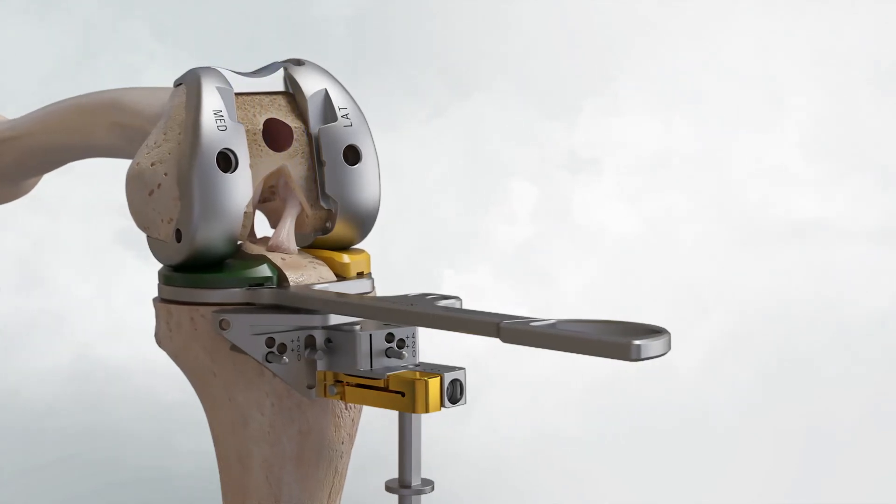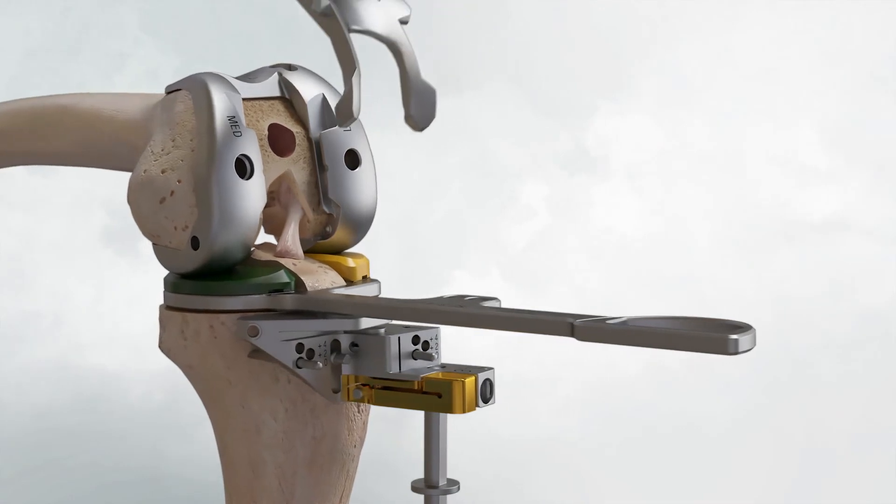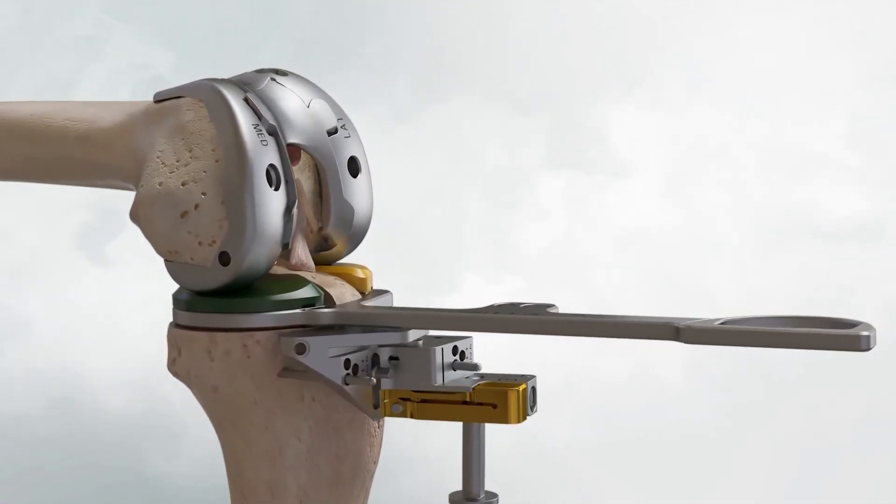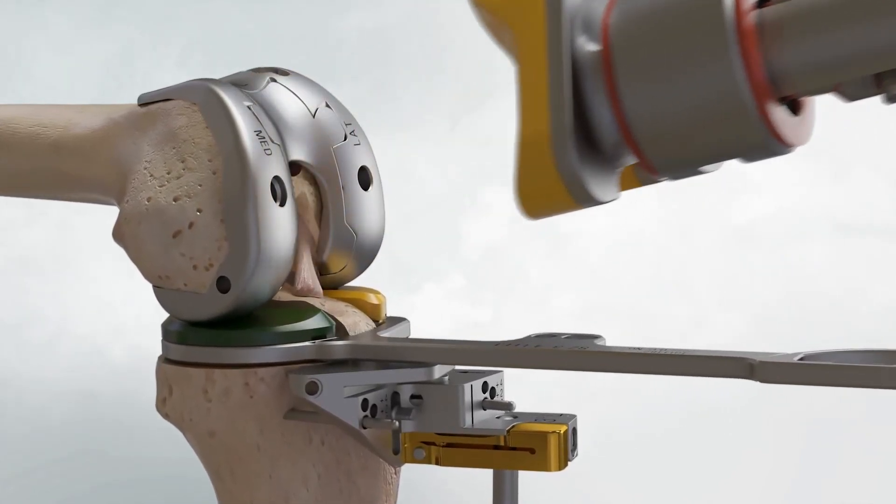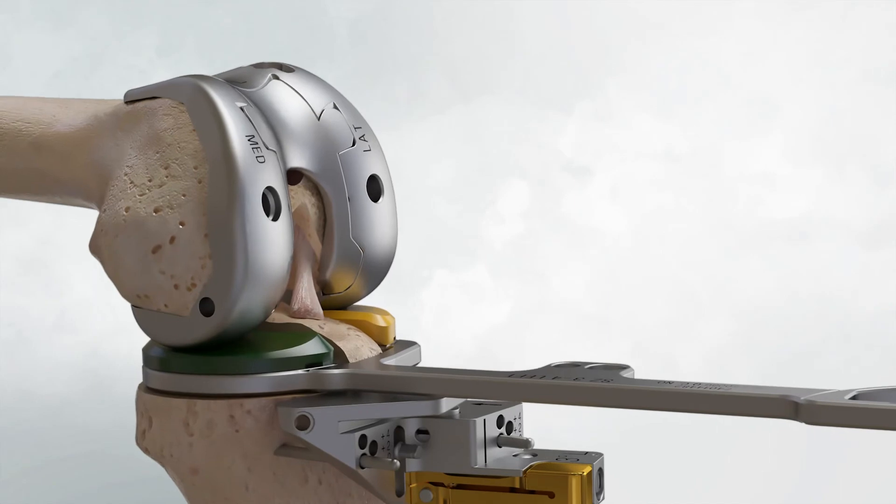Select the appropriate size CR notch trial and engage the anterior portion of the notch trial first. Then use the femoral impactor to impact the posterior portion of the notch trial until it sits flush with the femoral trial.